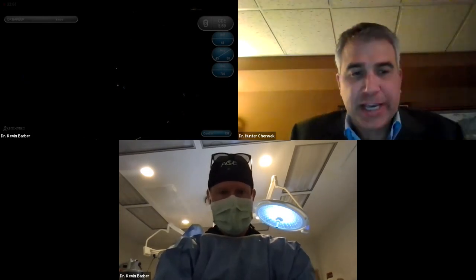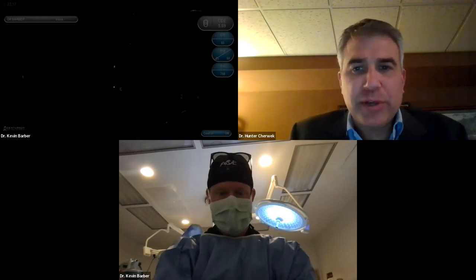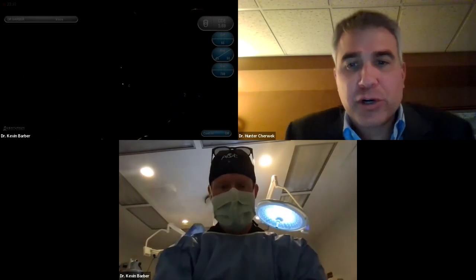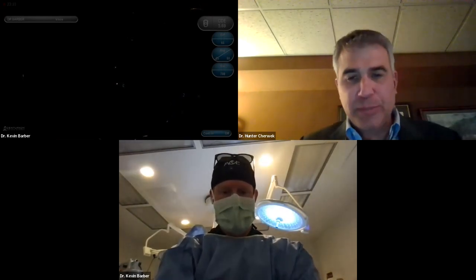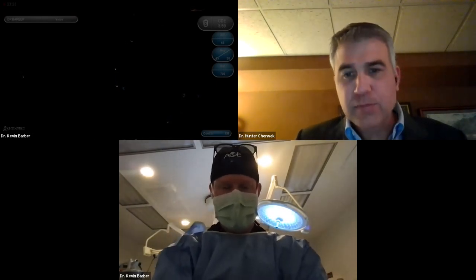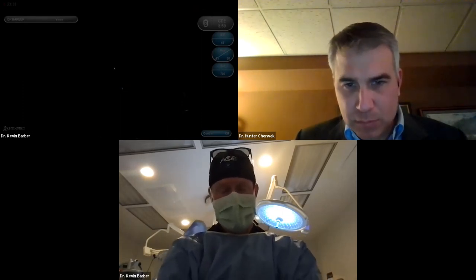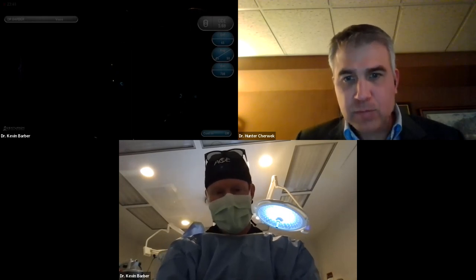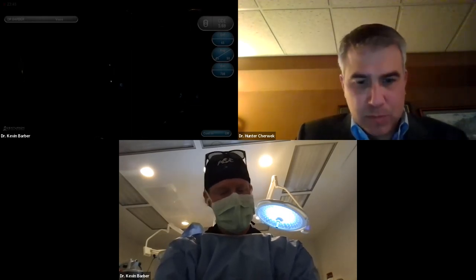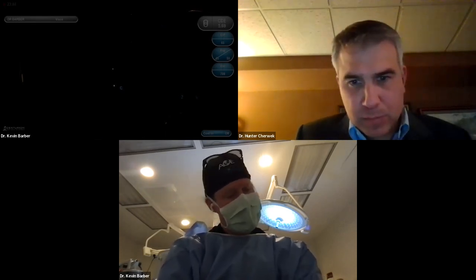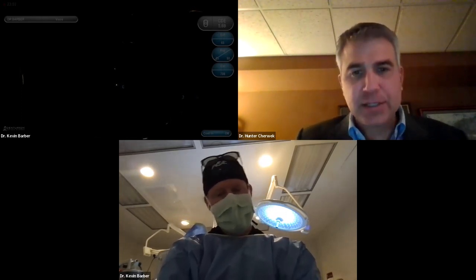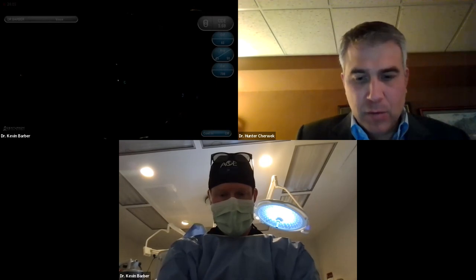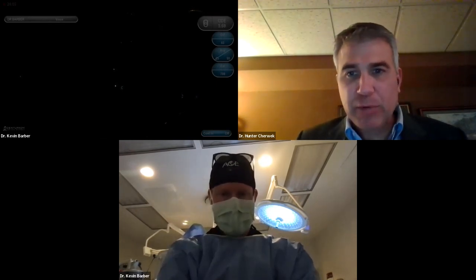Was the patient on blood thinners, and would intracameral epinephrine help? Yes, the patient was anticoagulated — that's why we saw so much bleeding. Epinephrine is a good choice. My staff says the bleeding looks like it's stopped. I'll step back, check the tamponade, and if it's worked I can finish. If not, I'll move toward epinephrine. Overall, we've discussed most of the key questions, and we'll reference people to the CyberSight library for prior surgeries covering FACO technique and ATIOL topics.